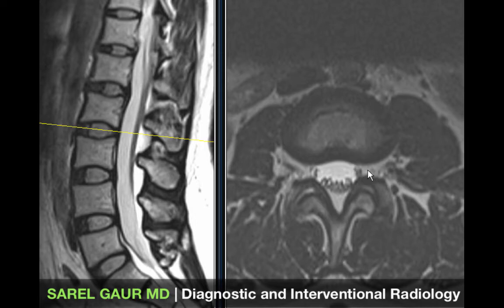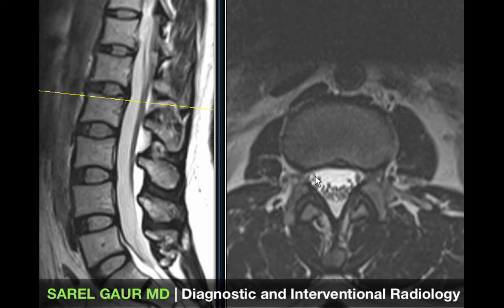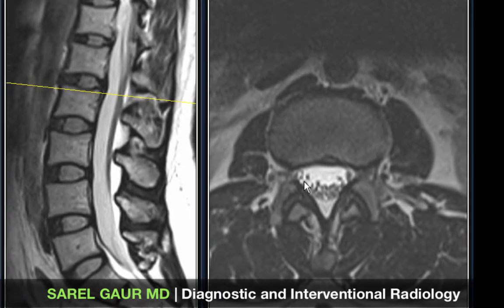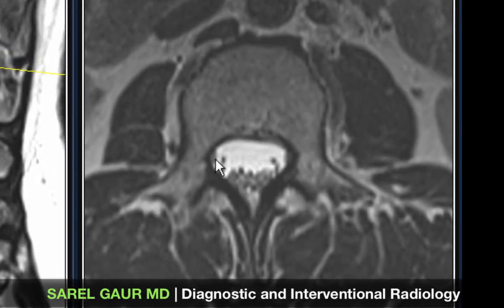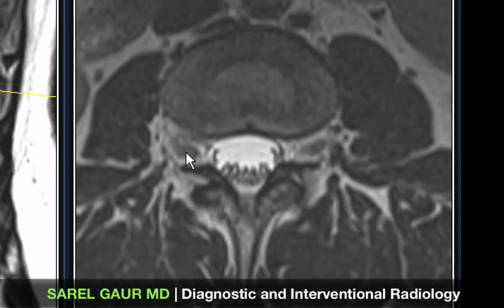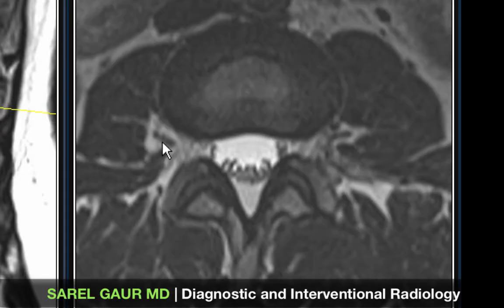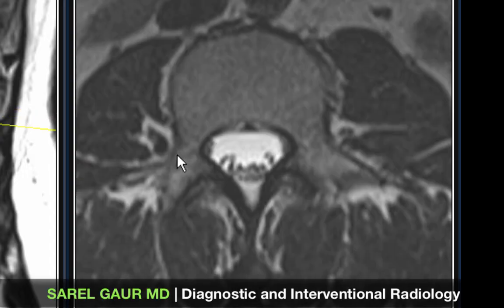Now looking at the central canal and nerve roots: there are two nerve roots here, and as I scroll down they combine and exit through the neural foramen. Here they obtain a dural covering and exit the spinal canal to go out and innervate the body.